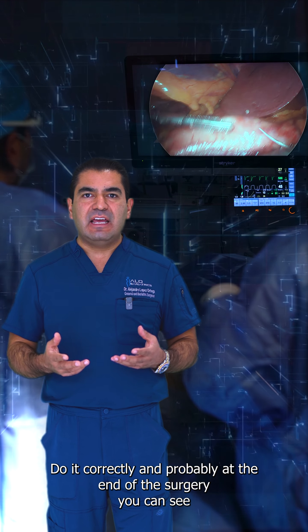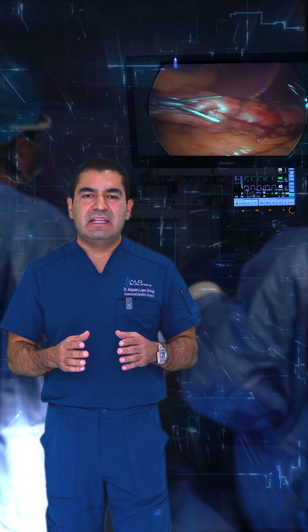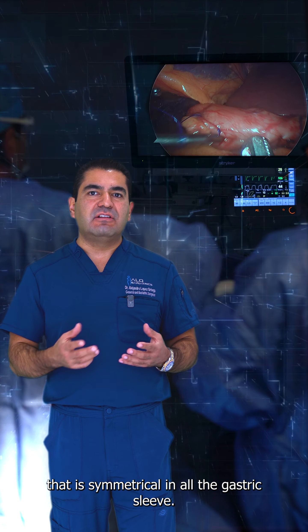And probably at the end of the surgery, you can see how the size and shape of the stomach is symmetrical in all the gastric sleeve.